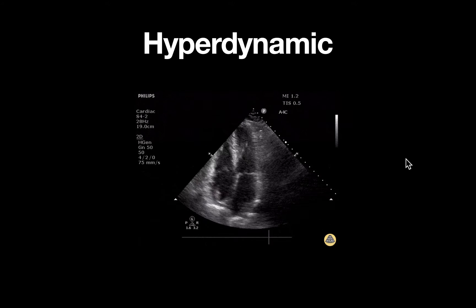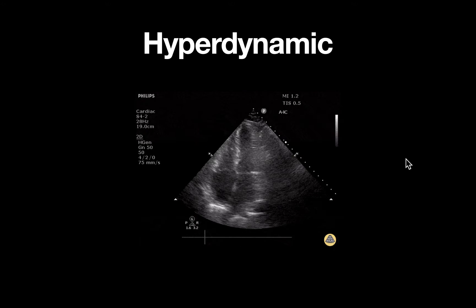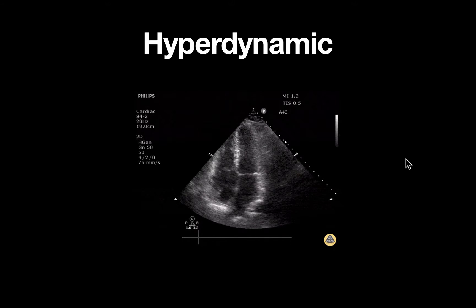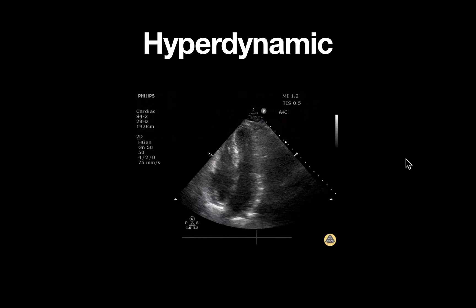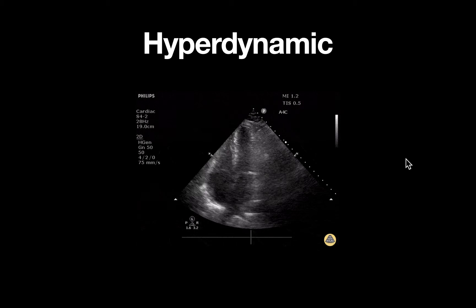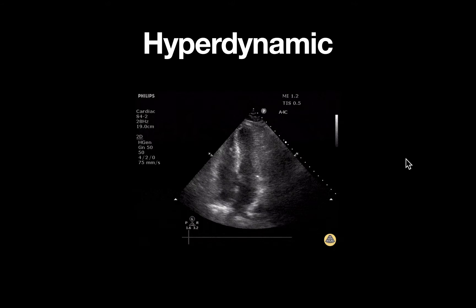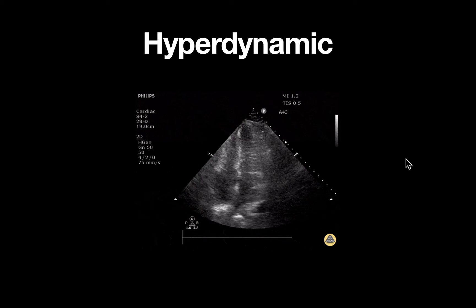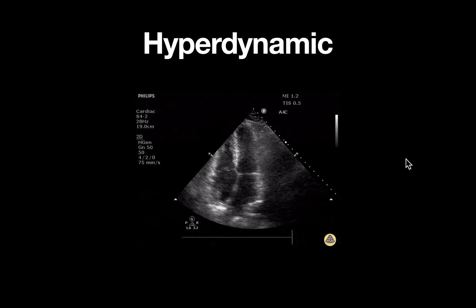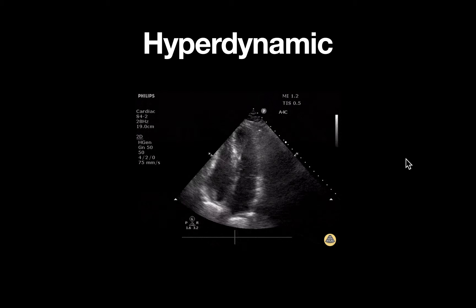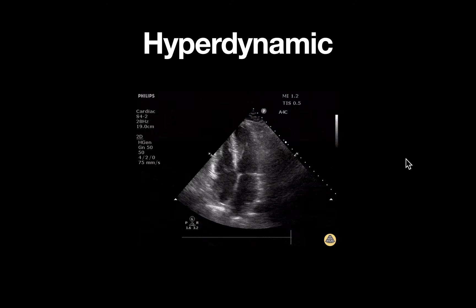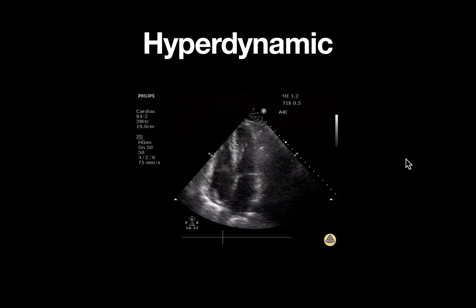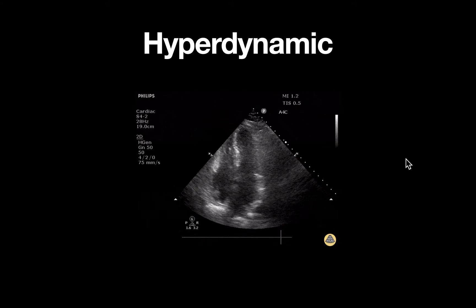This is an apical four-chamber view of a hyperdynamic left ventricle in a patient presenting to the emergency department with hypotension and fever. A phased array probe is used and placed at the point of maximal impulse, usually just below the left nipple or at the inframammary fold, with the probe marker pointed towards the left axilla.